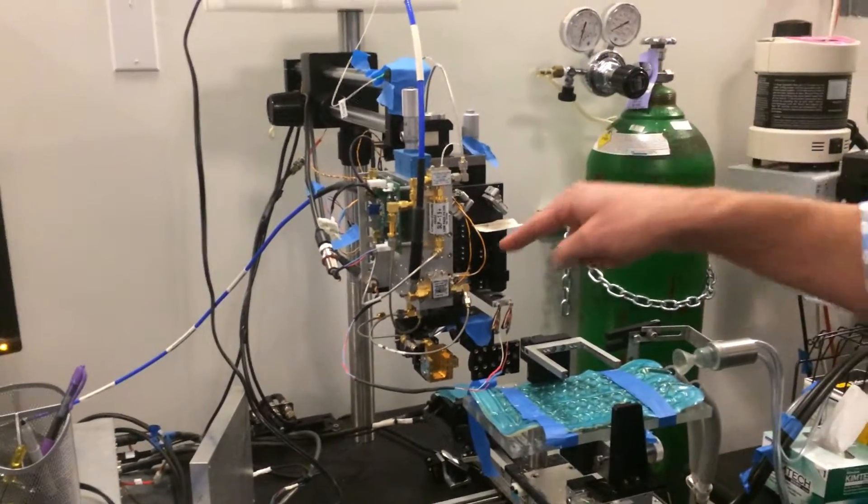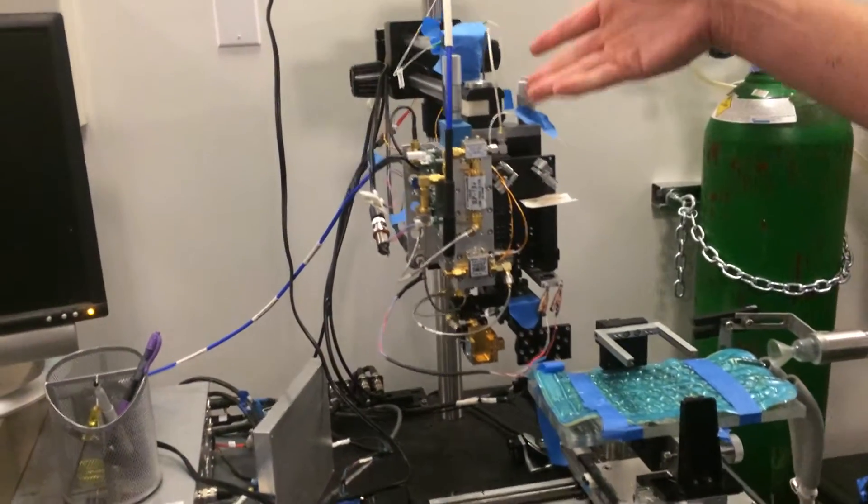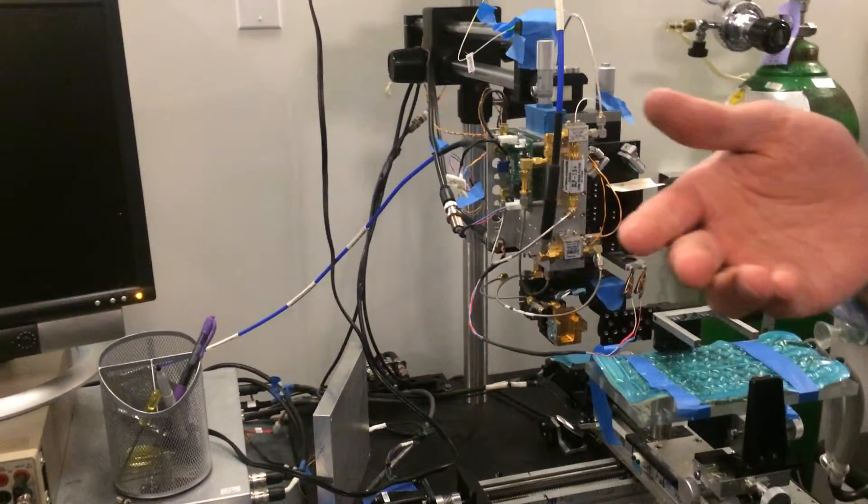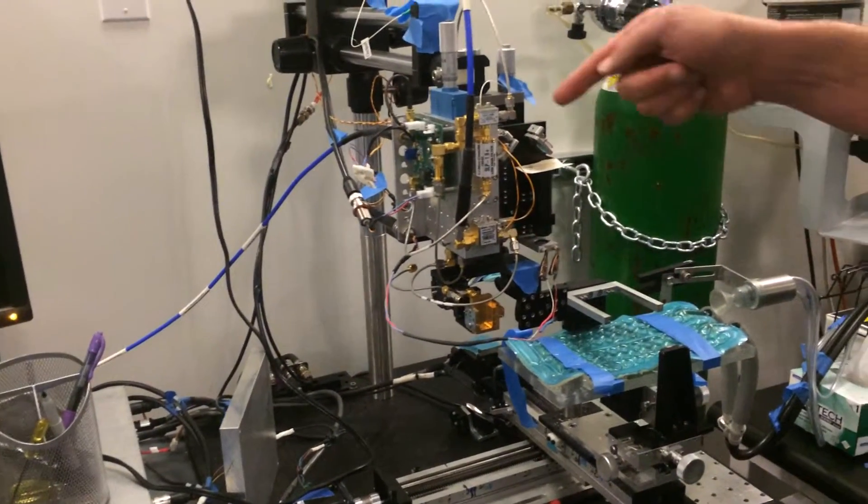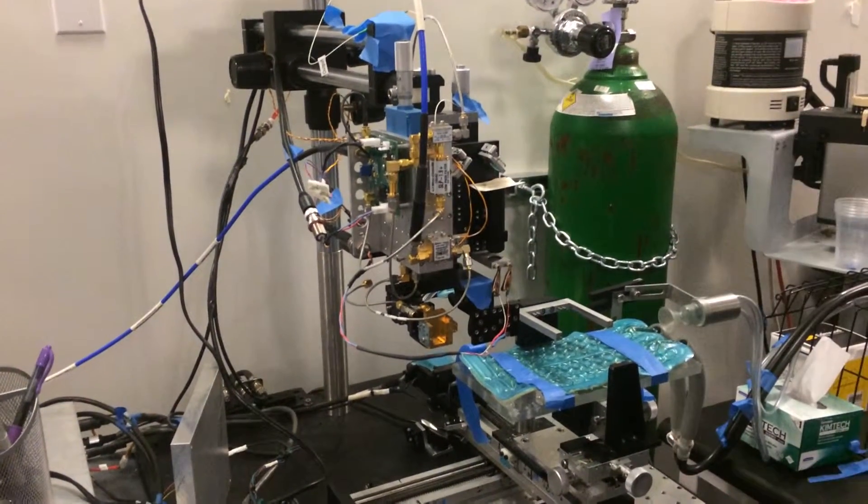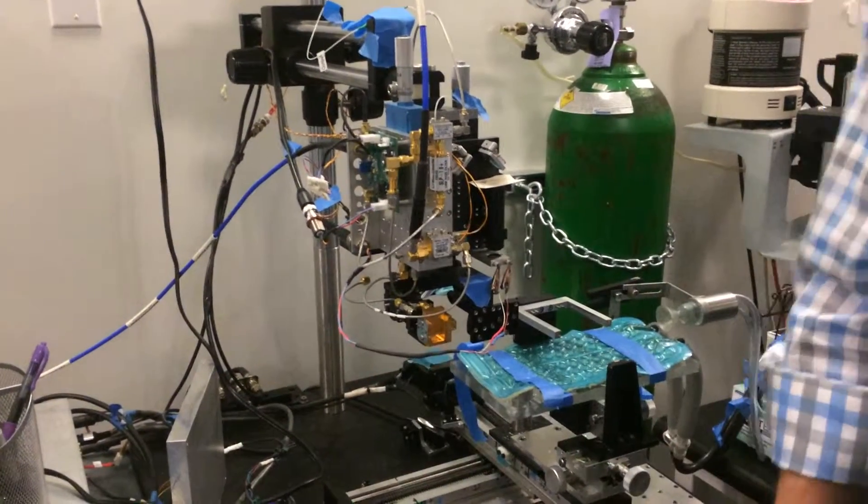But the real reason that we have all these extra dielectric mirrors here is that what comes out of the PPLN is a lot of 780 and a crap load of 1560. The easiest way to filter it out is put these dielectric stacks and every time it hits a bounce, the 780 is like 99% reflectivity. The 1560 is basically one or two.